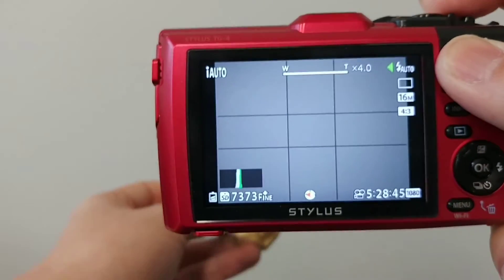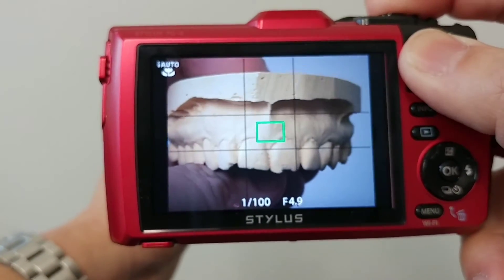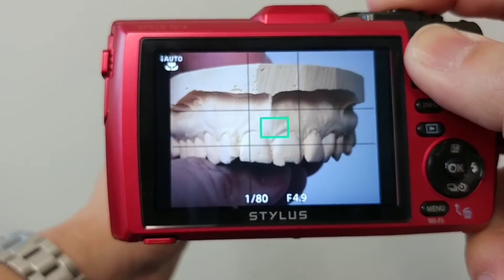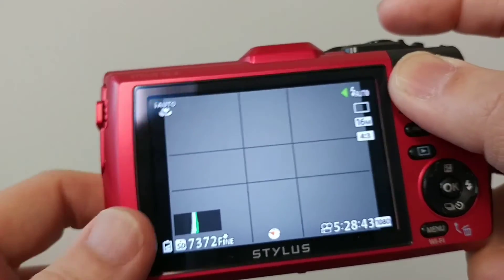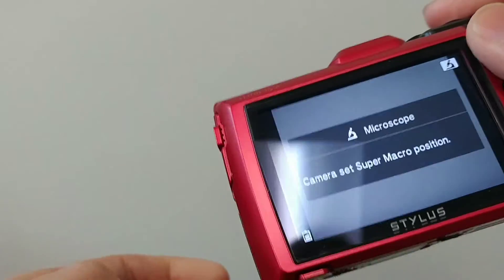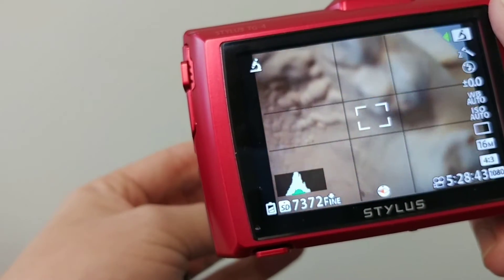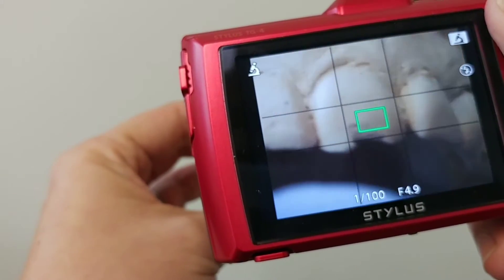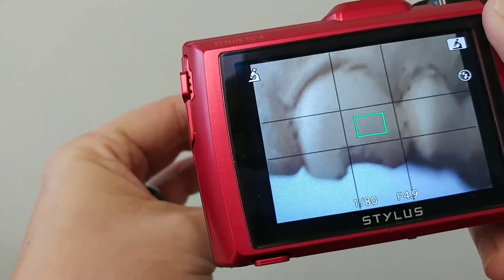One thing I really like is that it has a zoom — not only is the zoom 4x, but you can actually use macro at 4x, which is the other thing besides the flash that makes it really good for shooting dental pictures. It also has a microscope mode, so if you want to get ridiculously close you can get pictures that way too.